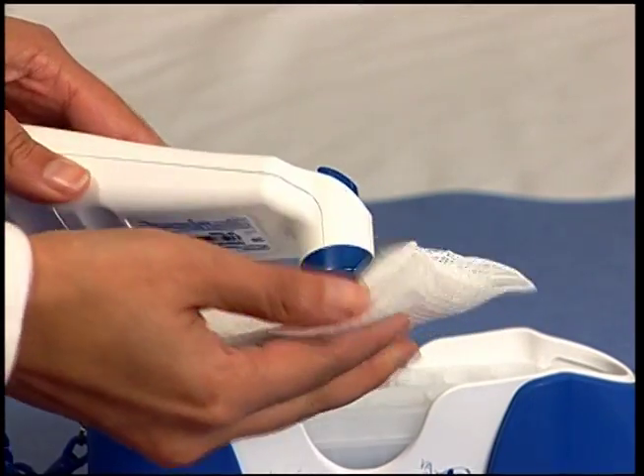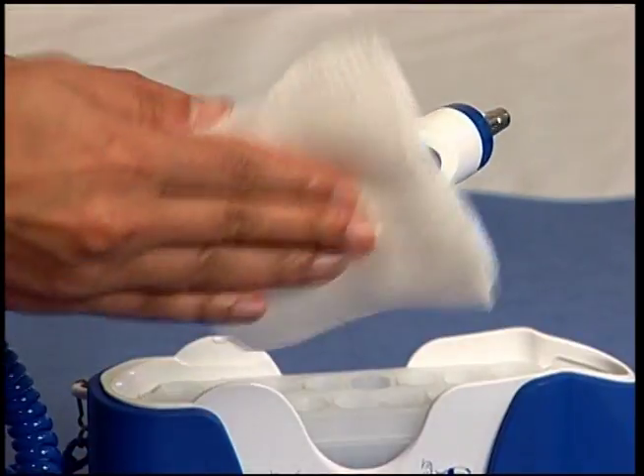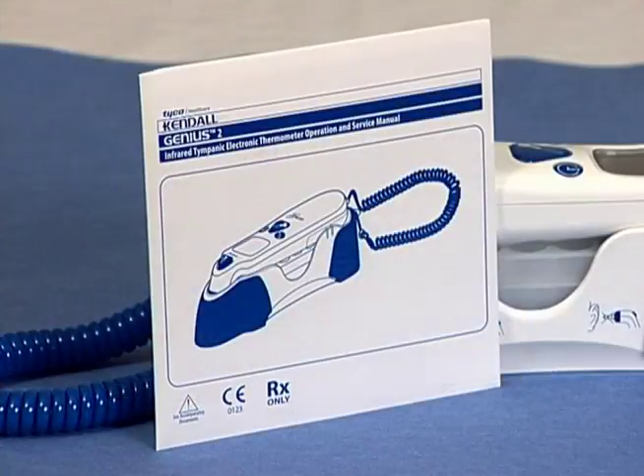Should you need to clean the Genius 2 housing, or if the lens will not come clean with the dry lens wipe, please refer to the operations manual for further information on the care and cleaning of the Genius 2 and appropriate solutions that can be used.